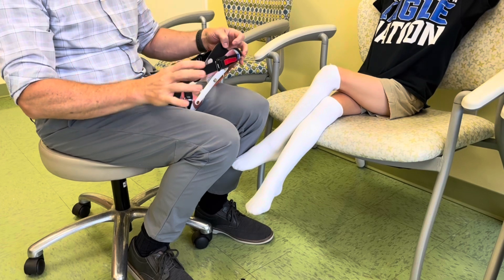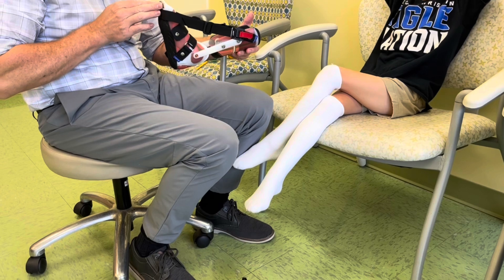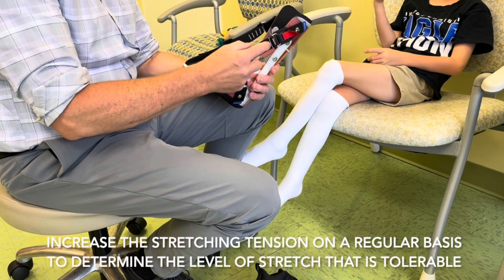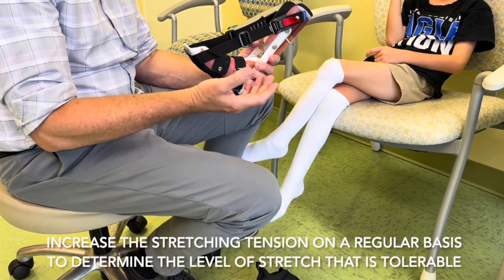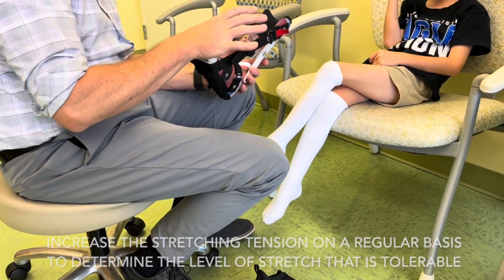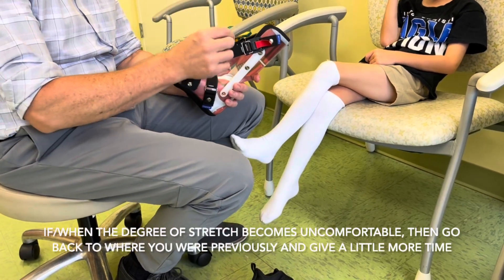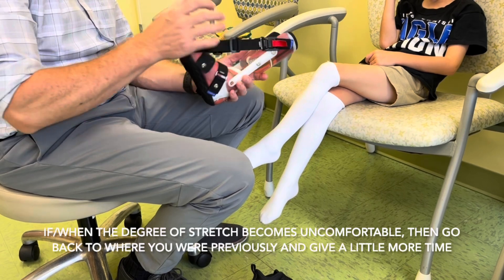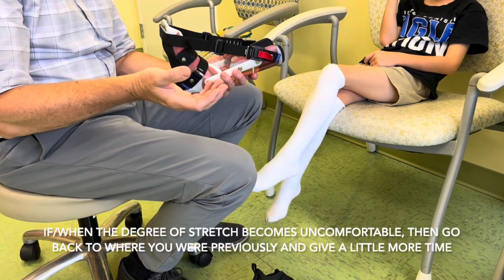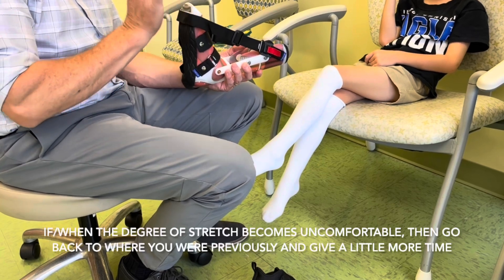Once we get through the first week, if everything's going okay, we want you to try to increase the tension. By tightening up the strap just a little bit more, it pulls up on the foot just a few more degrees — pull it through until you get to the second mark. We want you to do that once per week as long as he's tolerating it. If at some point it becomes too much — if he's not sleeping well or having other issues — go back to where you were before, which reduces the tension a little. Then wait one or two more weeks and try again.